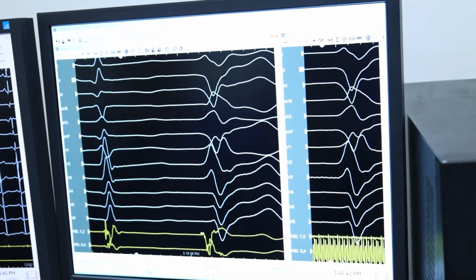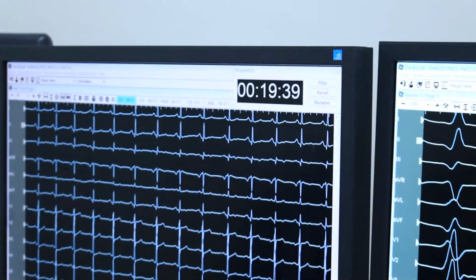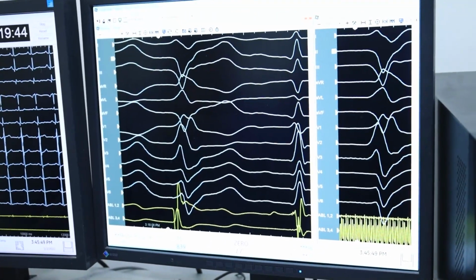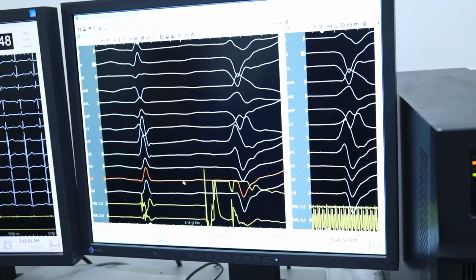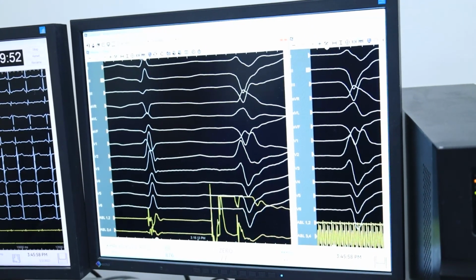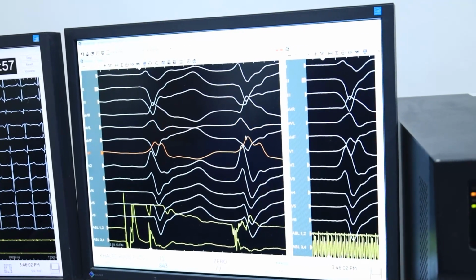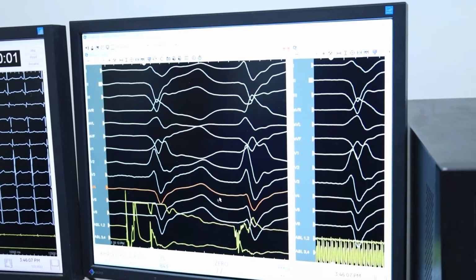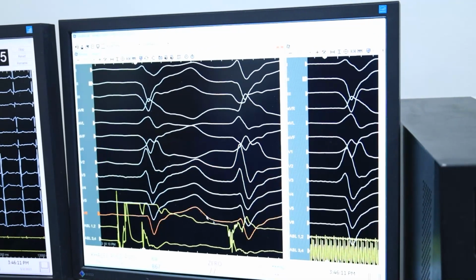We want to see the beginning of the recording. We have been at 19. And another thing is that when we start to ablate, we get PVCs. This is the starting of ablation. As we can see, these are the clinical PVCs, and the next is catheter induced. We could appreciate that they are almost identical, except this one is wider than the clinical PVCs.